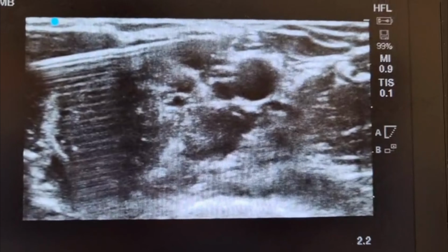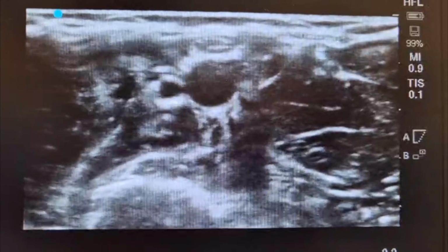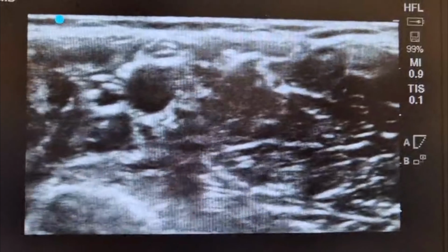Okay. In this way, you can also leave a few mils of local anesthetic to cover the medial cutaneous nerve. You can see the needle here. Okay, aspirate and inject. Aspirating. That's the tip. Negative. Yeah. Injecting. You could see, yeah. 1 mil. Let's go a bit more there. And, okay, aspirate and inject. Aspirating. Injecting now. Yeah. If we inject into this area, how much we got? We've got 3 mils. Yeah, let's inject all of it. Aspirating. Negative. Injecting 3 mils in this area.